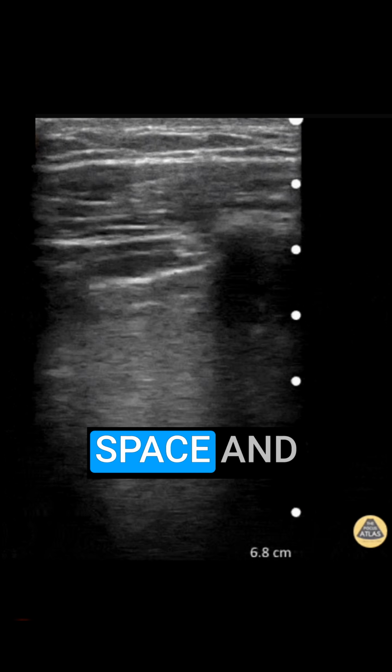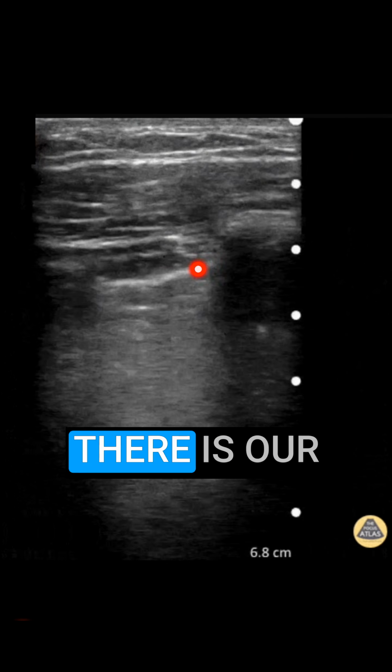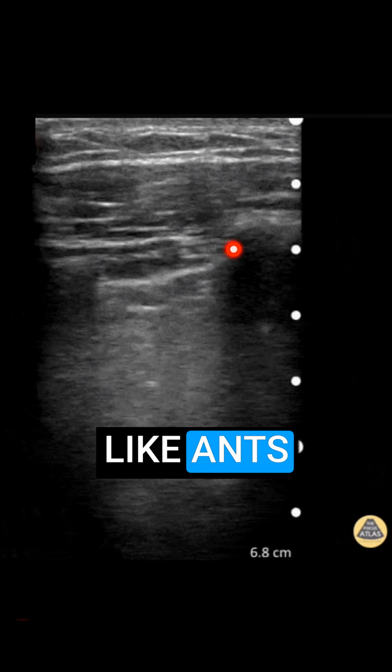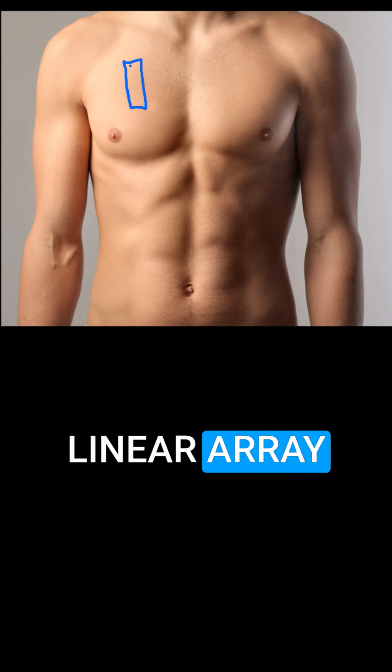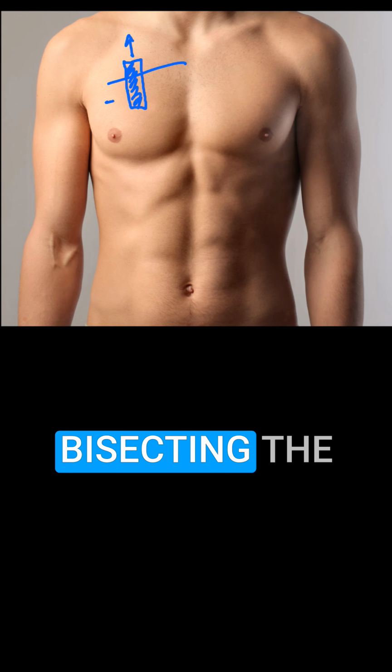Here is a rib space and a rib space. We have skin, subcutaneous tissues, and right there is our pleural line. You notice that there's these things sliding back and forth like ants marching in a line. This is normal lung. We get this image by taking a linear array probe and putting it on the anterior chest wall, dot facing the head, and we're bisecting the ribs like this.